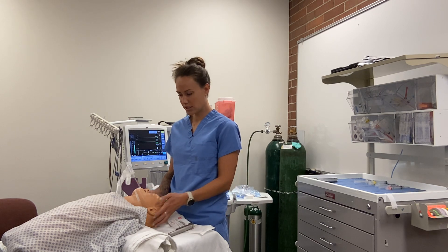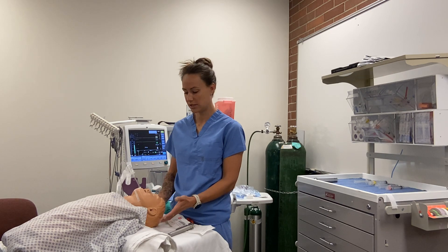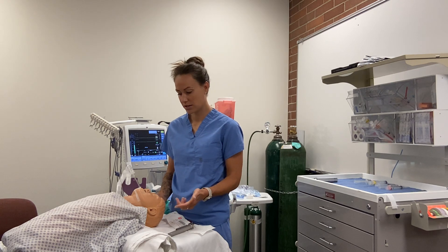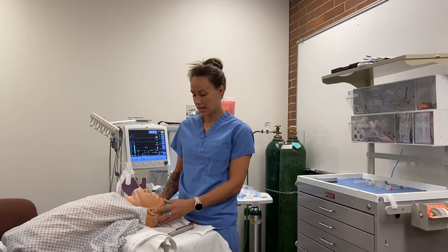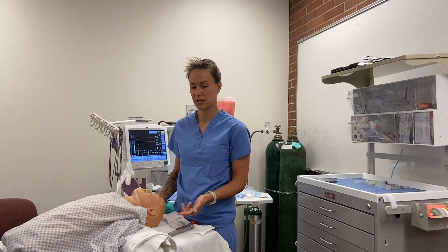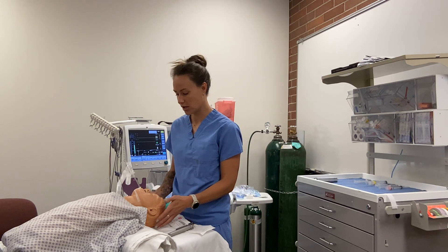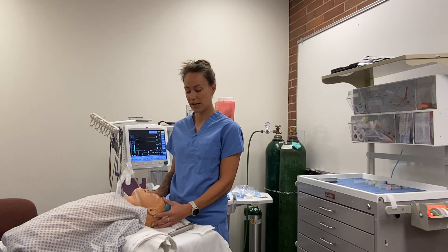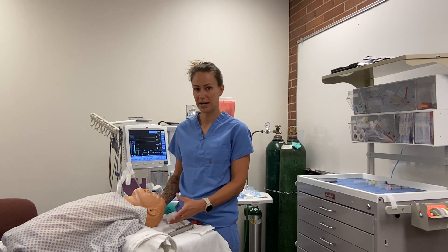The case is done and we're thinking about extubation. There are two options: deep extubation or awake extubation. With awake extubation the patient has airway reflexes intact, but they are at risk of bleeding, increased ICP, fighting the tube, and a rough emergence. If RSI was used, we must do an awake extubation. Our patient did great, so we're going to do a deep extubation — we want the patient at one MAC or deeper with no reactions.